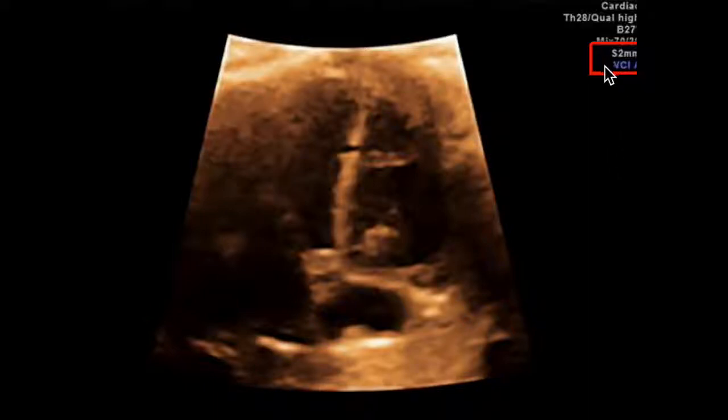So you can see up here, I had a really small slice thickness configured, and I was scanning a patient where the fetus happened to be apex up.